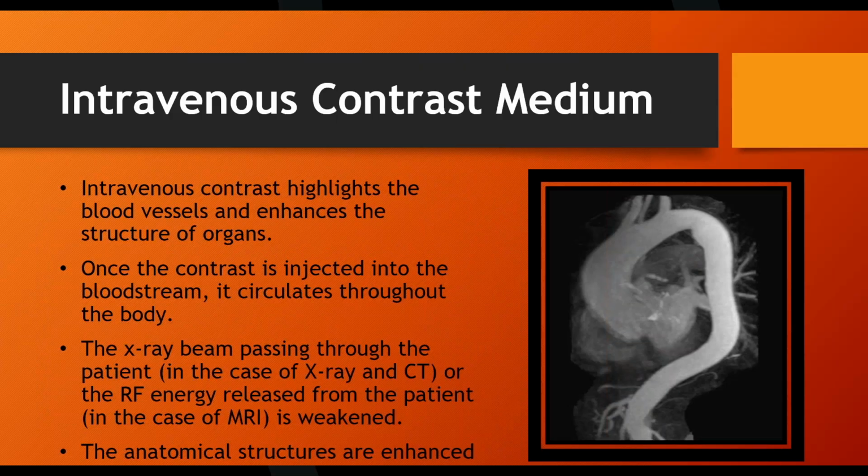So this is what the fluid goes into, these syringes right here. Now, CT and angio injectors, the systems that use X-ray tubes to produce the image, use radiation. The fluid in here is called contrast fluid. The magic ingredient in this is iodine.